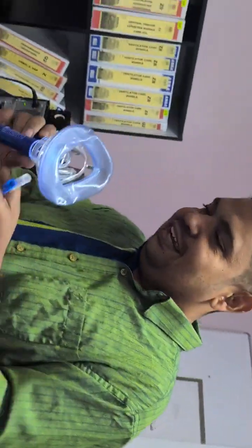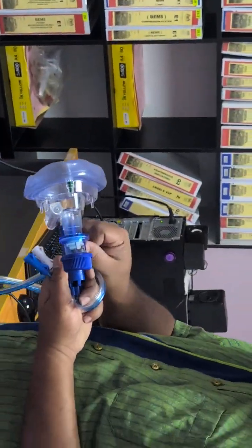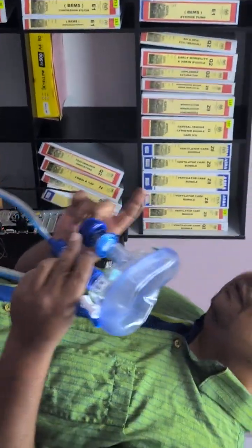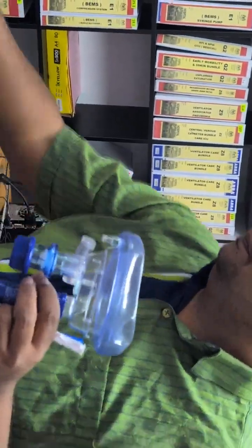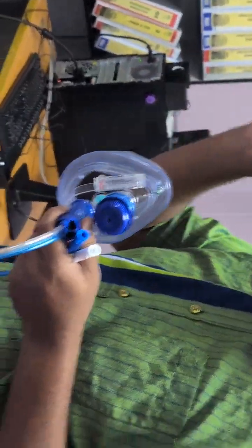Another disclaimer: this is mechanical. When I pass around, you will see there are wordings here, 5, 10, 15, the PEEP. But this is useless, because this is a mechanical PEEP. The actual PEEP which the patient is getting is shown in the manometer here.